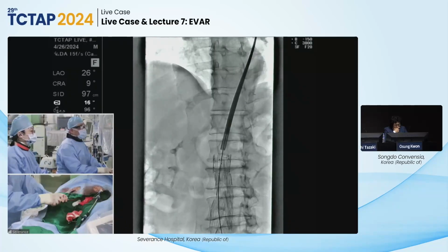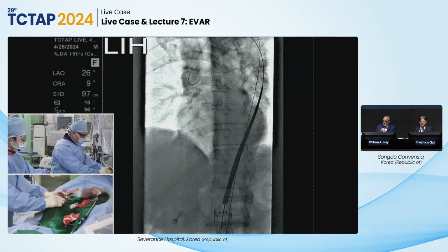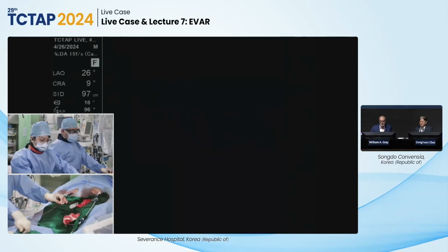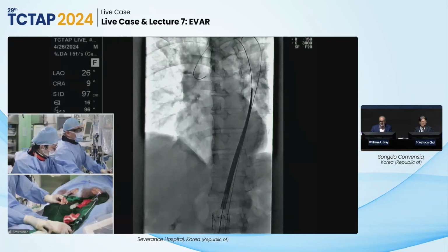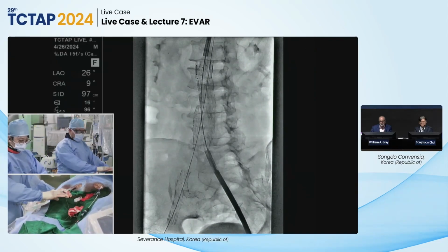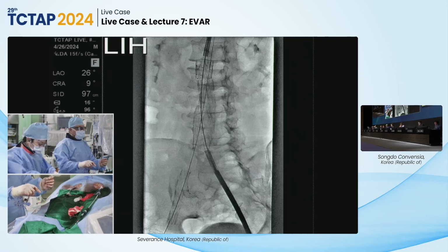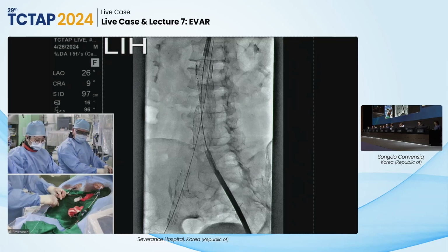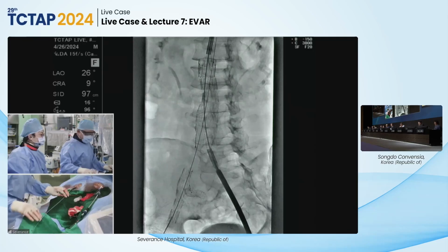I did most of my EVARs under local anesthesia with conscious sedation. Did not require anesthesia to be in the room unless the patient was particularly problematic. It's doable with the right lidocaine. Yes. So we are doing our procedures in one of our hybrid operating rooms, and our anesthetists are always very helpful. Yes, it's nice to have them there. Usually they are reluctant to help us, but in our hospital they are very cooperative.